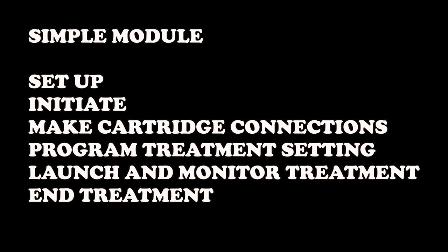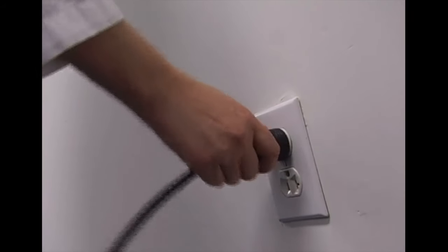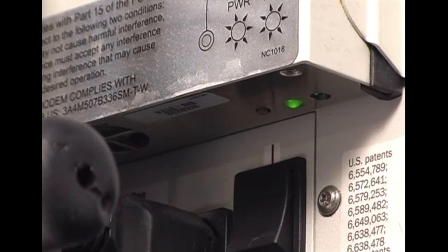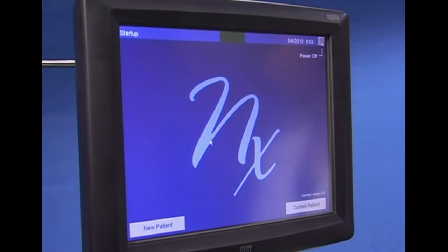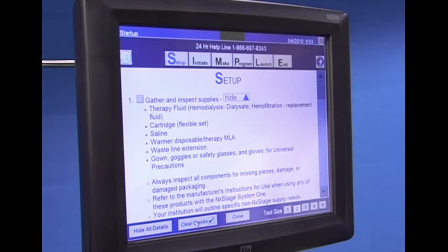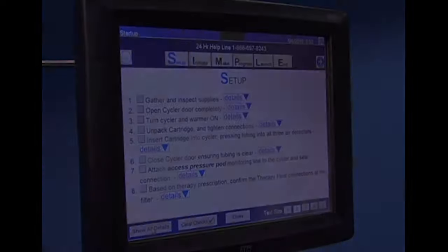You have selected the simple module. In this section, we will review how to set up, initiate prime, make cartridge connections, program treatment settings, launch and monitor treatment, and discuss end treatment. Start by turning on OneView. You can remove the power cord from the wall outlet and reinsert it, or depress the reset button on the jewel box. Wait for the standby screen, then choose new patient or current patient as appropriate. Click on the simple button located on the bottom of the therapy summary screen and follow the instructions.